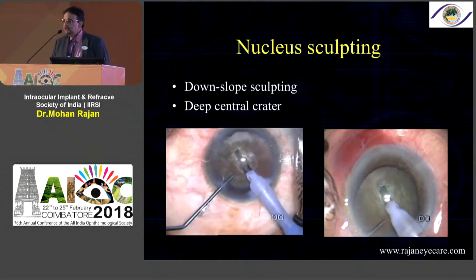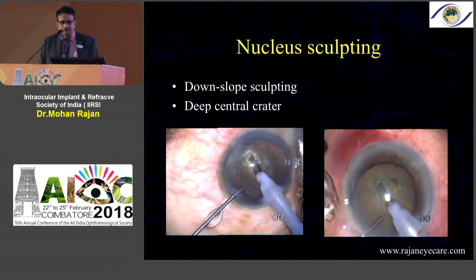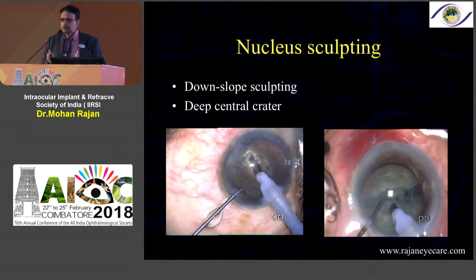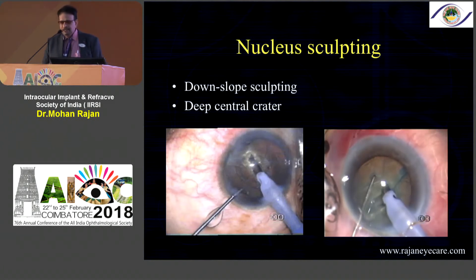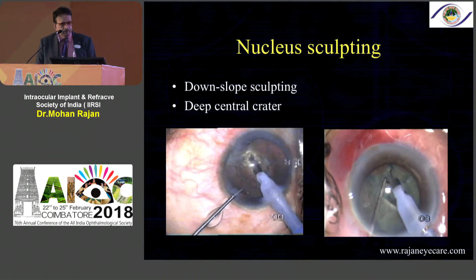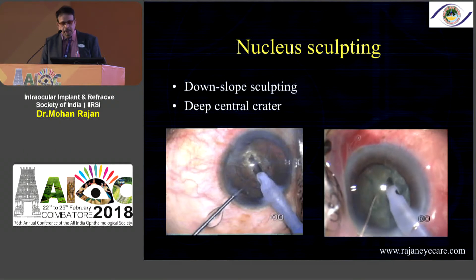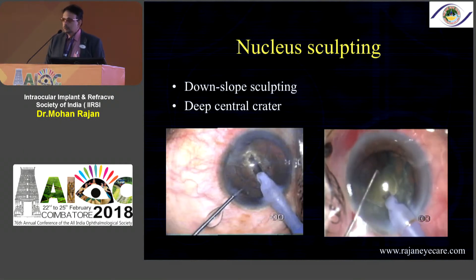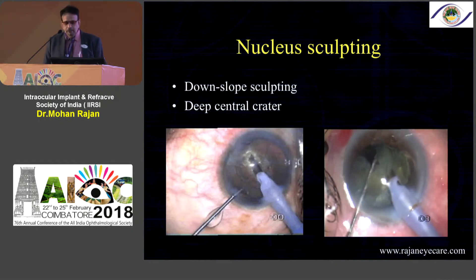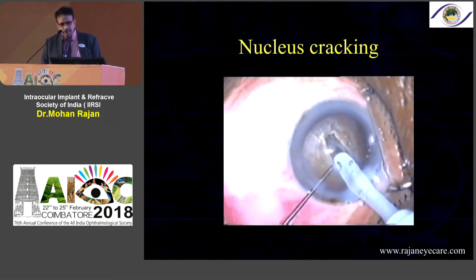For a little harder cataract you need to make a deeper trench and then crack the nucleus. Make sure when you crack the nucleus you can see the posterior capsule through and through — we don't want any attachments there, because these can be leathery attachments especially in grade three and grade four cataracts. You can see how I'm chopping each half into smaller pieces, using pulse or hyper pulse, and automatically the nucleus comes into the scene. This is nucleus cracking in stop and chop.